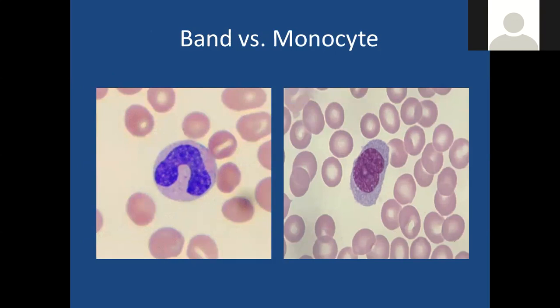I apologize, the screen is very hard to tell. But notice, it might be hard to tell on this image, but remember the monocyte nucleus likes to fold on itself, likes to convolute. So you can kind of see how the nucleus is folded right here. That's the edge of the side of the nucleus.